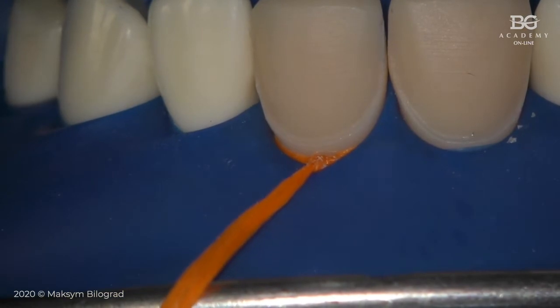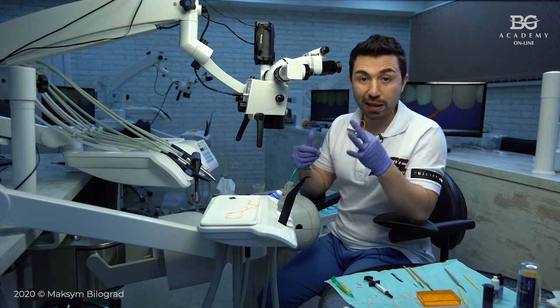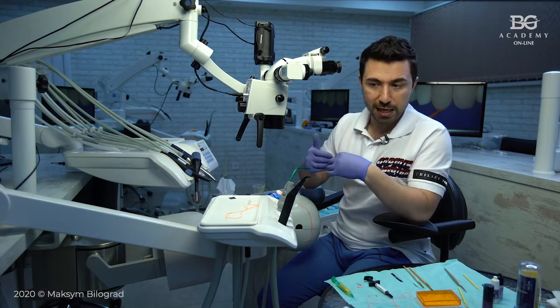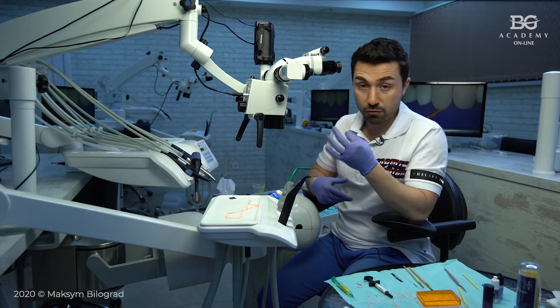Okay, if you don't know how to work with these floss ties, how to prepare these floss ties, I will refer you to our YouTube channel. You can go to playlists, and you will see the 1 minute series, and episode number 3. In episode number 3, I'm showing you step by step the preparation of these knots for rubber dam isolation.